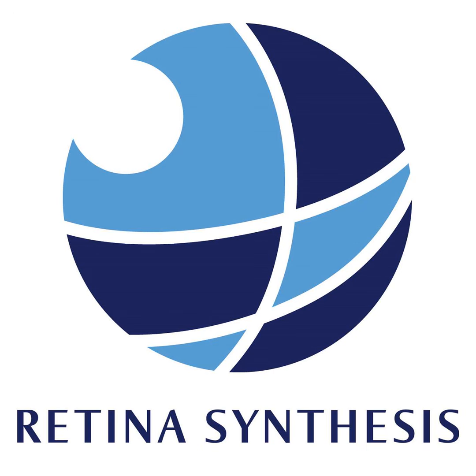And then along came spectral domain OCT. And the real power of spectral domain was to perform these dense raster scans that allowed us to generate macular thickness maps and allow us to locate pathology in the posterior pole, just like we would with color fundus imaging or autofluorescence or fluorescein angiography. What fascinates me is why the individual B-scan has continued to dominate our discussion, while the dense raster scans have just been relegated for the most part to macular thickness map generation.